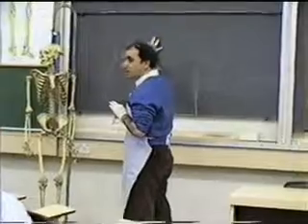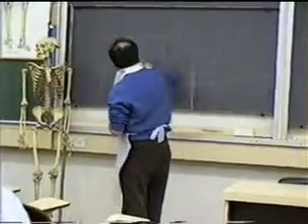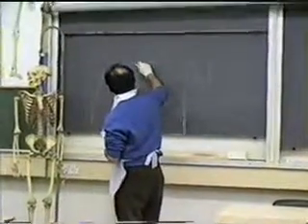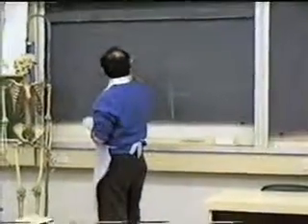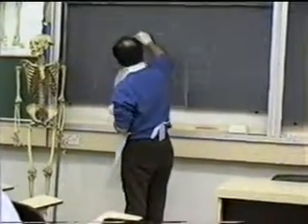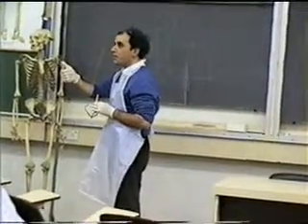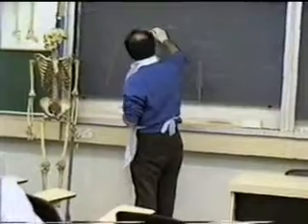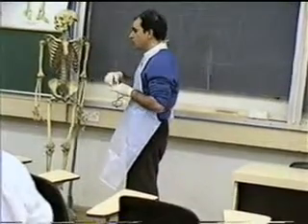When you have a wide dorsum, when you have mobilized the bony pyramid with a lateral and medial or paramedial osteotomy, and then you do a transverse osteotomy, sometimes you can't narrow the pyramid because here there is bone. Then I, with a Rubin ronger, take away a wedge here and here, so I can close the other groove.